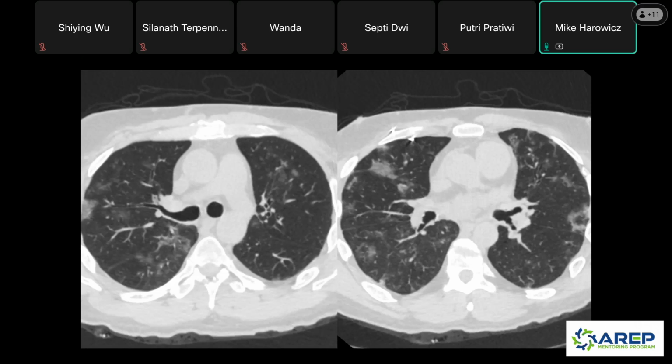And in this case, we see this from time to time, these people who get COVID, and then it kicks off this inflammatory response in the lungs of organizing pneumonia. And some people will actually need a steroid burst to make this go away. Some people resolve on their own. I don't know how well described it is in the literature, but I'll tell you, I've seen this several times now.